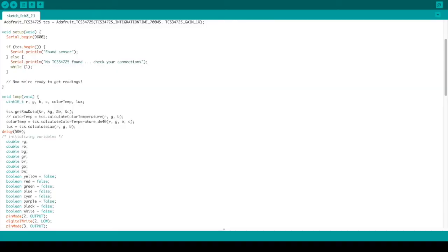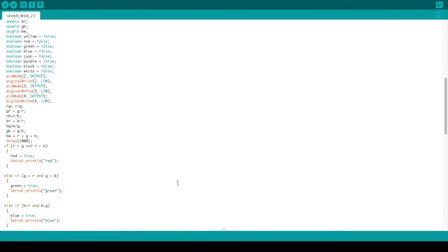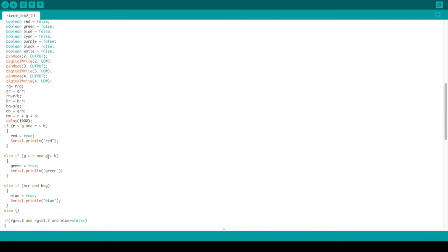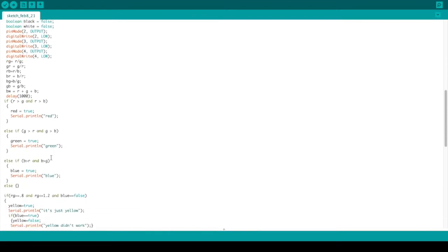With light, the primary colors are actually red, green, and blue, whereas with pigment, it's red, yellow, and blue. In this case, red and green mix to make yellow. So what we first do in our code is determine whether any of the intensities are higher than the other two. So for example, if red is greater than green, and if red is greater than blue, then we'll set red to be true. And we do this for the other two colors as well.